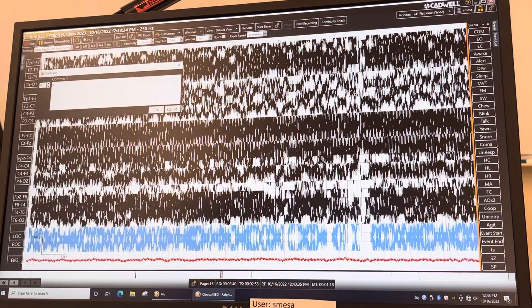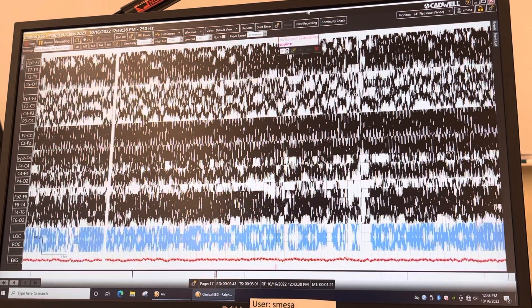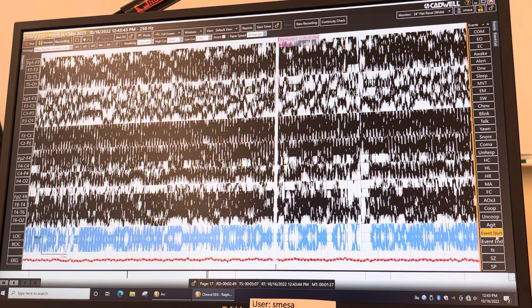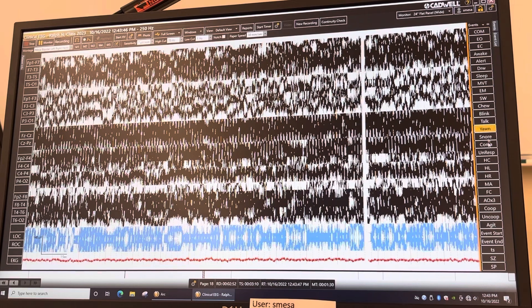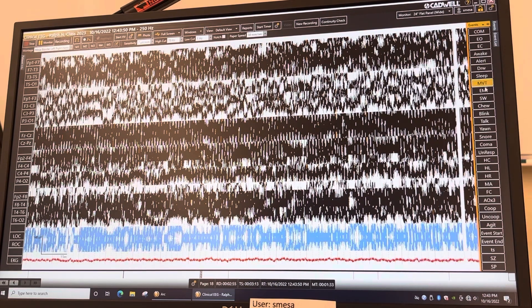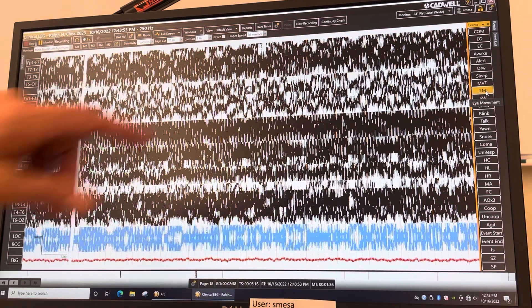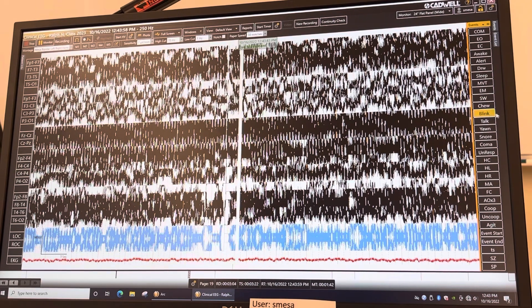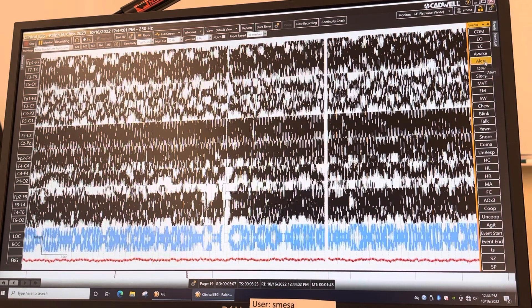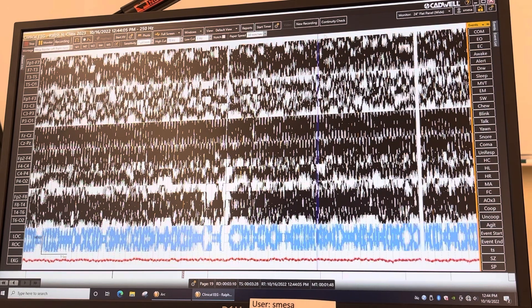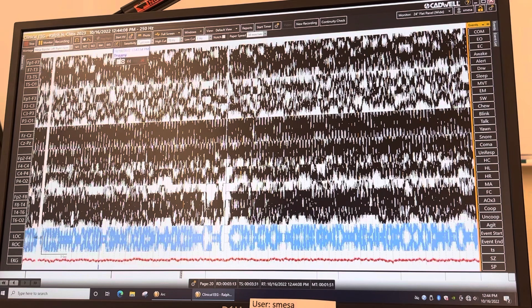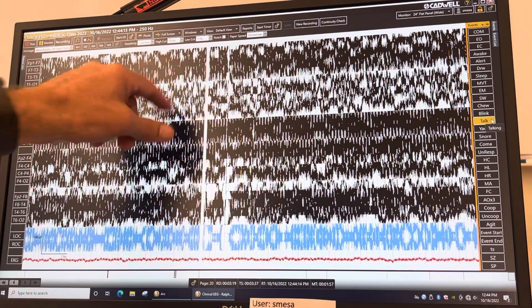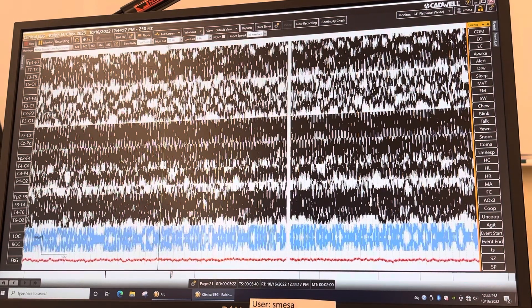If 'Supine' isn't pre-programmed, click on 'Comment,' click on the screen, and type it in. All these annotations are pre-programmed — just click on Events and choose any one you want. For example, if there's an eye movement, click on 'Eye Movement,' put it right there, and click again. If the person is talking, click 'Talk,' move the cursor, and click again.